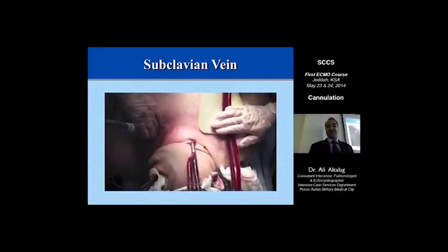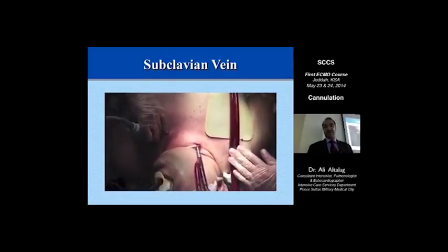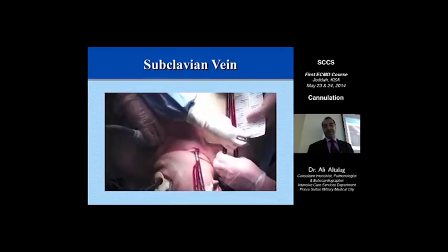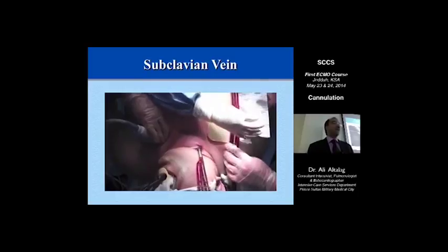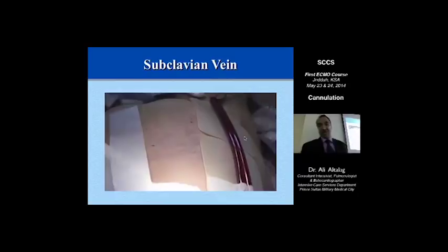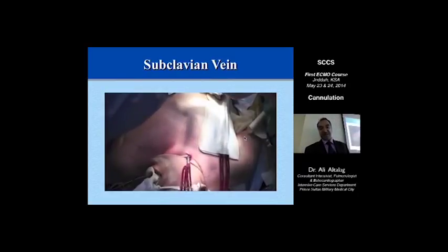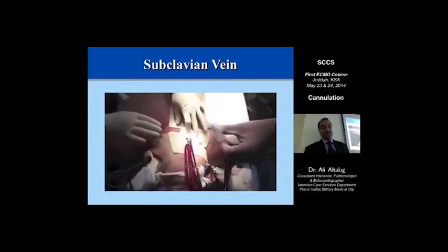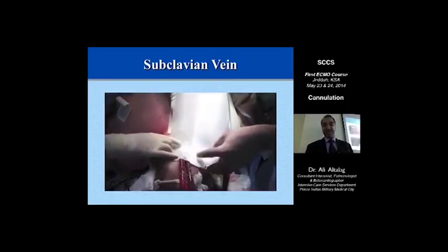So now you have to fix the catheter. There are different ways of fixing the catheter, and you will see here that the surgeon himself is trying to fix the catheter himself because he doesn't want to waste this effort, and after all the catheter comes out accidentally. So it has to be fixed very, very well. So this is the way these people are fixing the catheter. Which is, I think, very reasonable, but I'll show you probably other ways of doing that.